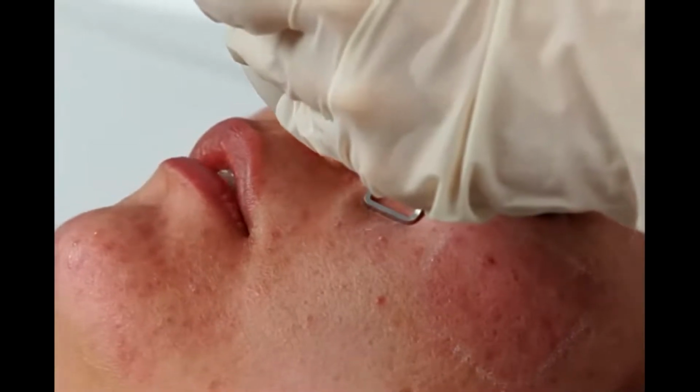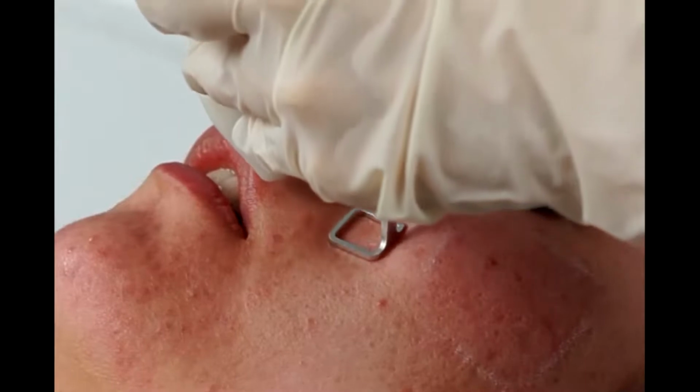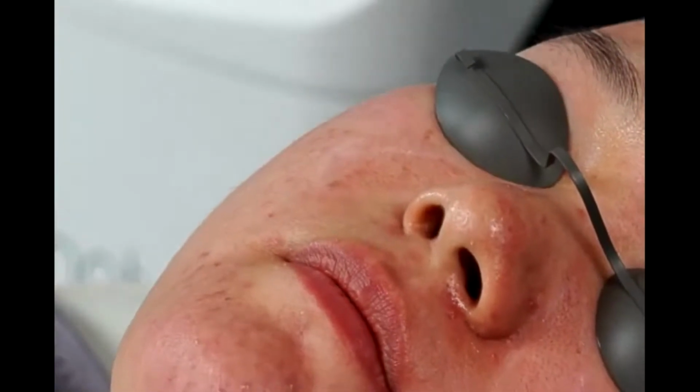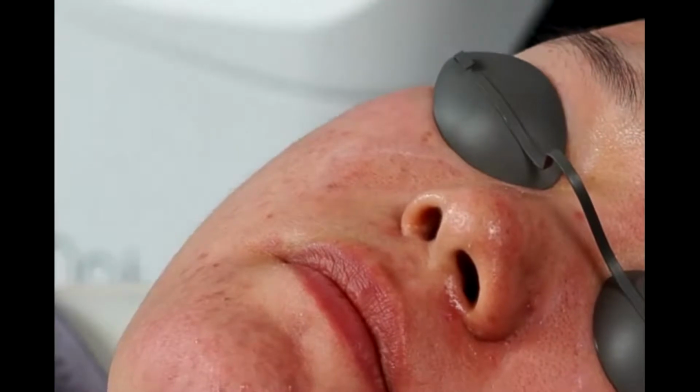During the operation, you can ask your patients how they are feeling, and you can adjust the parameters according to the status of their skin.